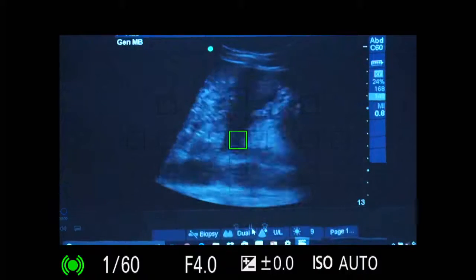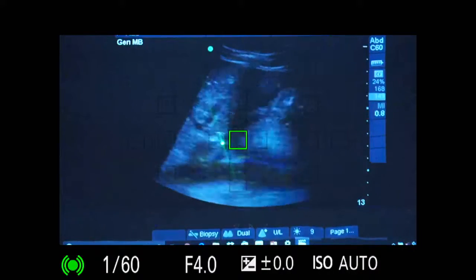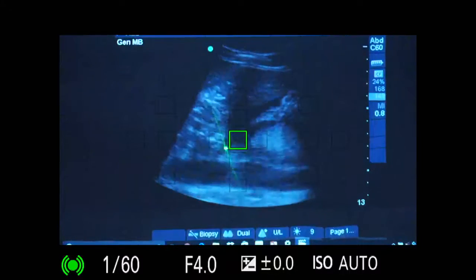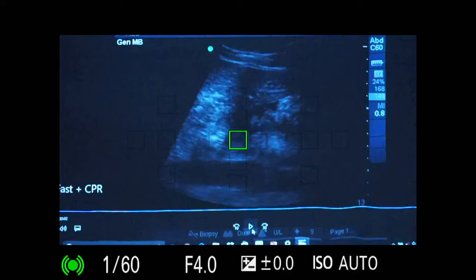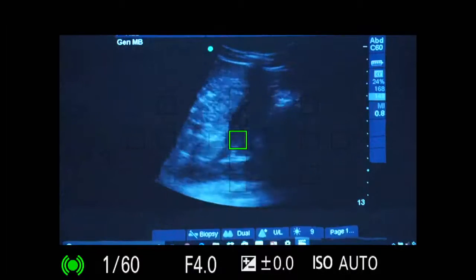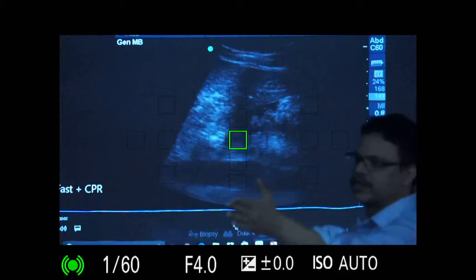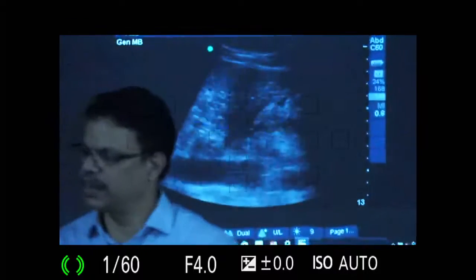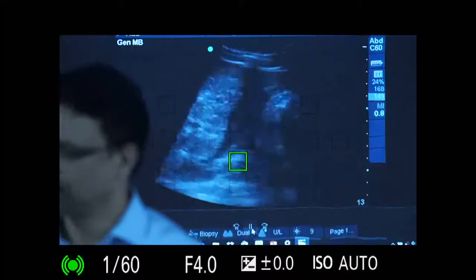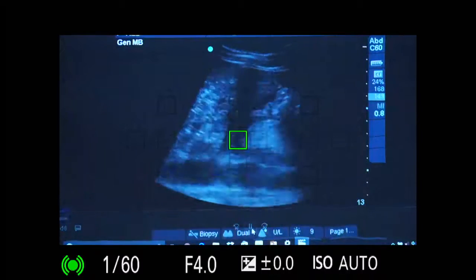देखो ये पॉइंटर है, थोड़ा प्ले कर देना सचिन. Yeah, play. So, do you all agree with him? No, there is a fluid there. Yeah. So, why is it shaking too much? Can you see this? Yes, sir. ये स्क्रीन देख रहे हैं, हिल रहा है बहुत जोर से. तकलीफ से चेस्ट क्यों हिलेगा?